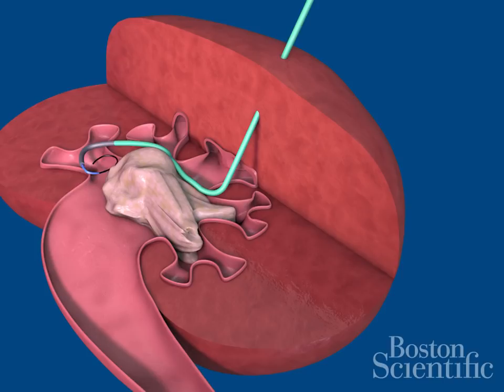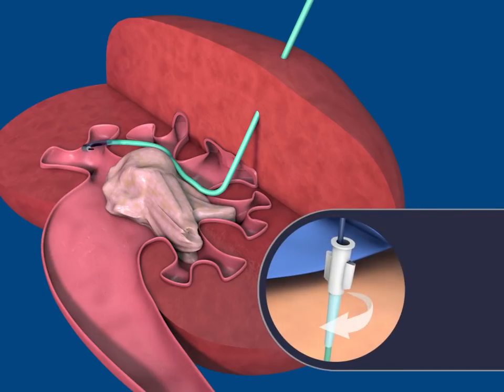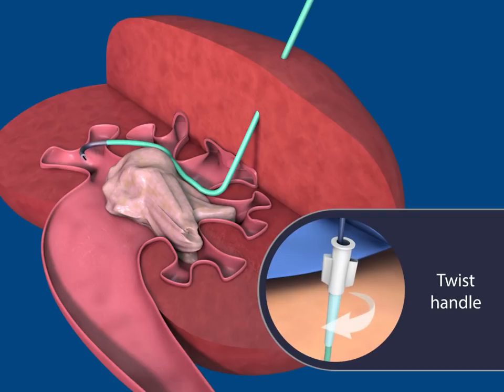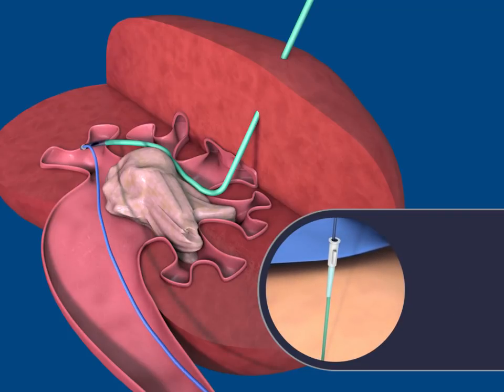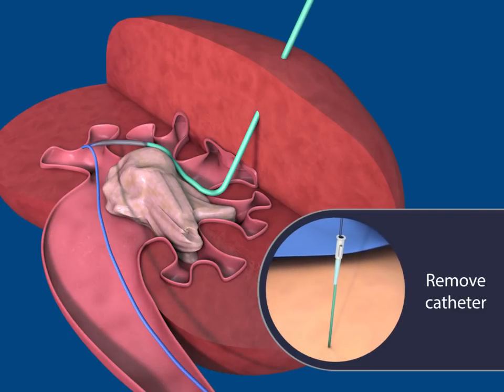Back the guide wire up to the stone, leaving a portion of the wire's tip outside the catheter. Twist the catheter handle to advance the wire past the stone towards the ureteropelvic junction, down the ureter and into the bladder. Remove the catheter.